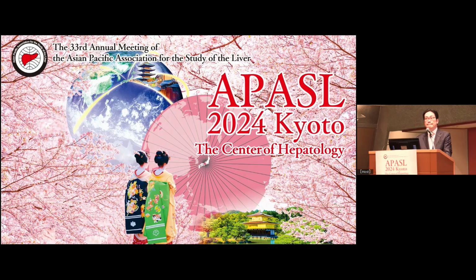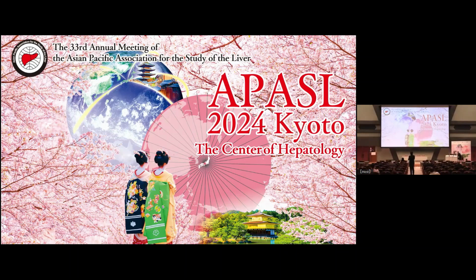Yeah, please. Congratulations, Professor Nakai. I have a question: now the EUS guided TIPS information is available only in animals. Looking at the information in animals, do you think the chance to become true in humans is very high, intermediate, or very low? What are the things that will prohibit this procedure from coming to humans?